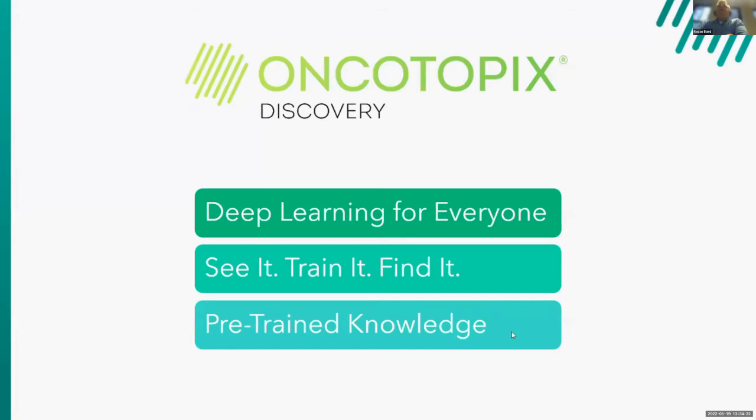And the software platform that I want to talk to you guys about is something called Oncotopix Discovery. Don't let the word onco scare you into thinking that this is a cancer-related software. We at Visiopharm focus on cancer biology, and creating AI to detect cancer and cancer-related projects. However, the tools that we use are universal in being able to analyze tissues of all shapes, sizes, and species.